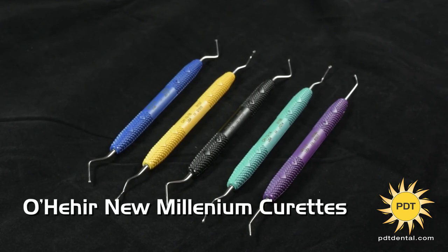The O'Hehir New Millennium Curettes are anatomically color-coded for faster and easier identification during procedures.